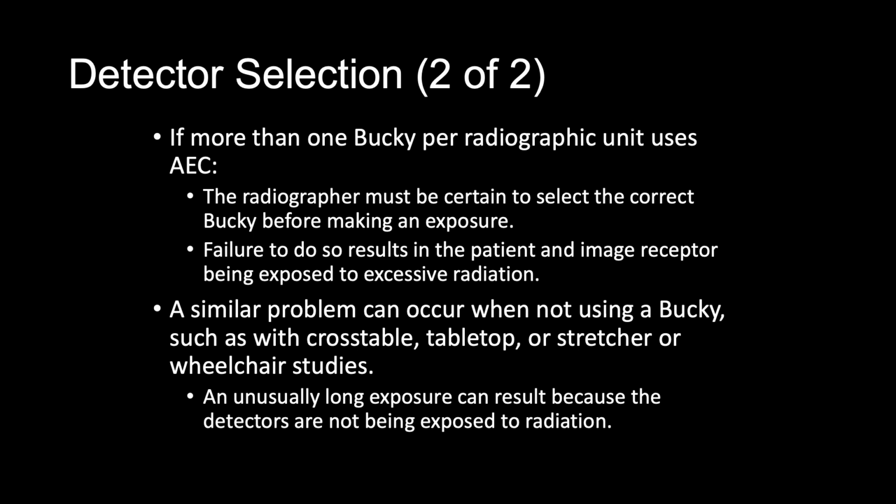A similar problem can occur when not using a bucky, such as with a cross table, tabletop, or a stretcher or wheelchair studies. So if the AEC system is activated with these types of exams, an unusually long exposure is going to result because the detectors are not being exposed to radiation. So again, the backup time will probably be reached and the patient's dose will be excessive. Some radiographic units are designed so that an exposure does not occur if the AEC device has been selected and there is no image receptor detected in the bucky.